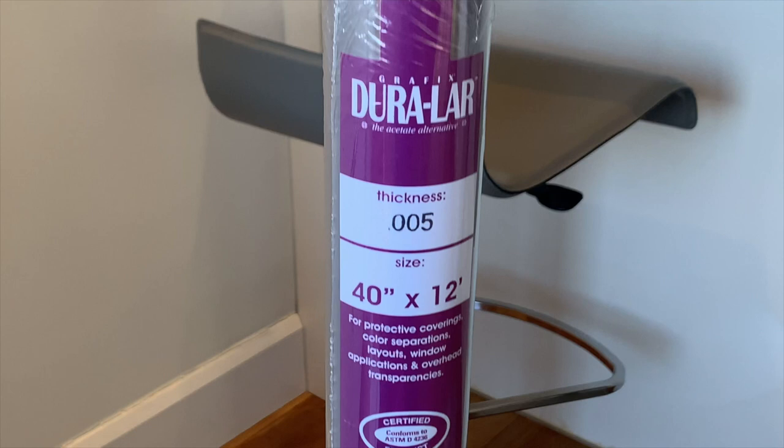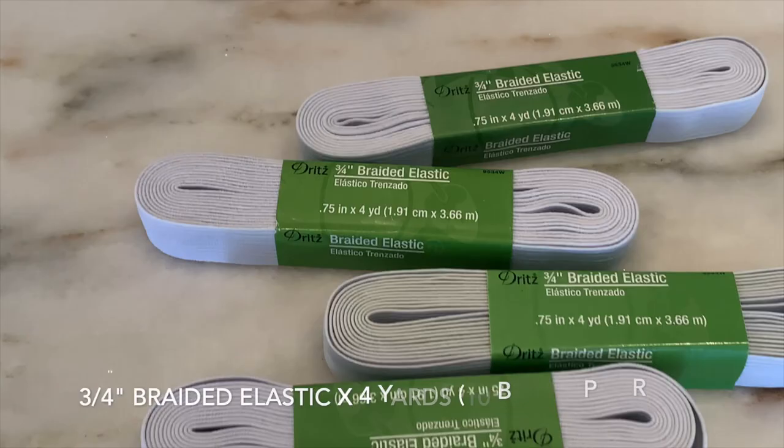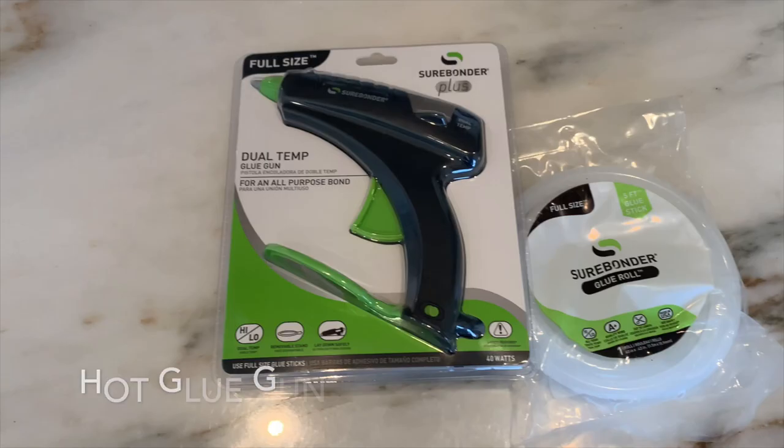Here's what you'll need: a large roll of acetate film, one inch foam roll, three quarter inch elastic, and a hot glue gun.